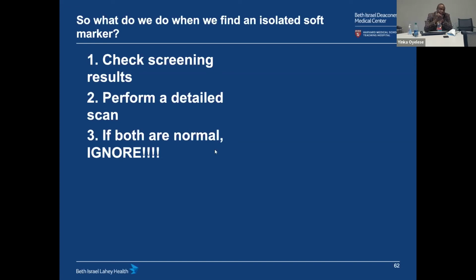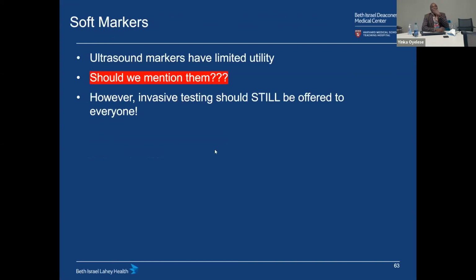If it is echogenic bowel, schedule a follow-up, not for Down syndrome, but for skeletal dysplasia or for bowel issues, and make sure you test for cystic fibrosis with echogenic bowel. So we have a problem, because we continue to find these ultrasound findings. They have limited utility when you've had screening. And in today's high resolution, high sensitivity ultrasound examination, I would argue, they are totally useless.